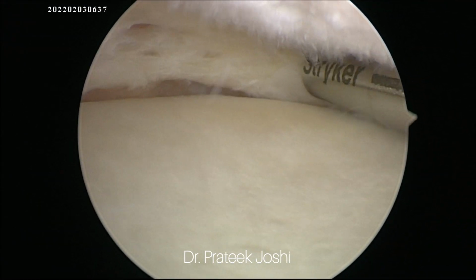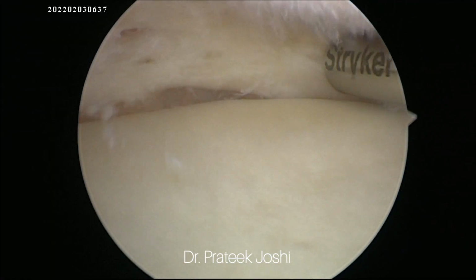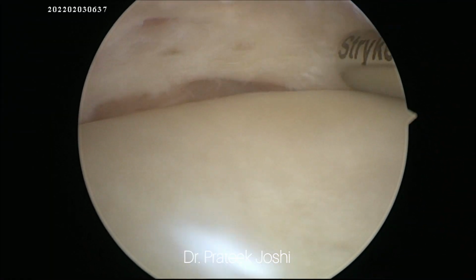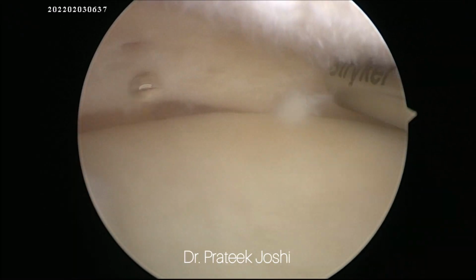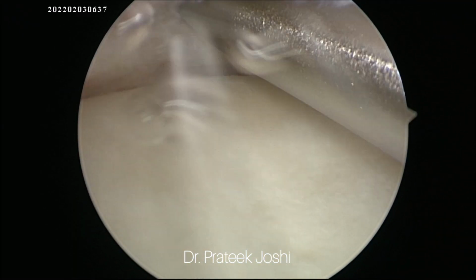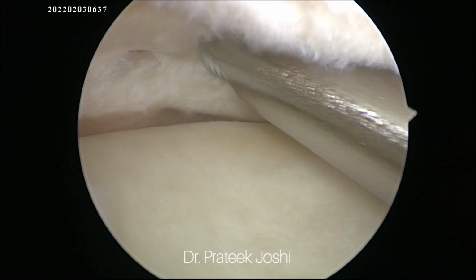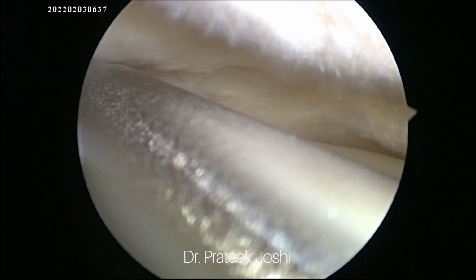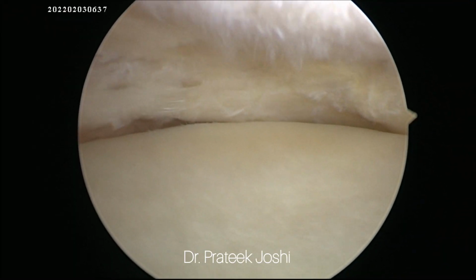You can see that the joint is quite good, so our meniscus repair procedure is going to definitely give some more years to this knee joint before the patient might require knee replacement surgery in future. This patient didn't need any high tibial osteotomy like surgery for correction of the deformity. Based on the scanogram, there wasn't much of a varus deformity.